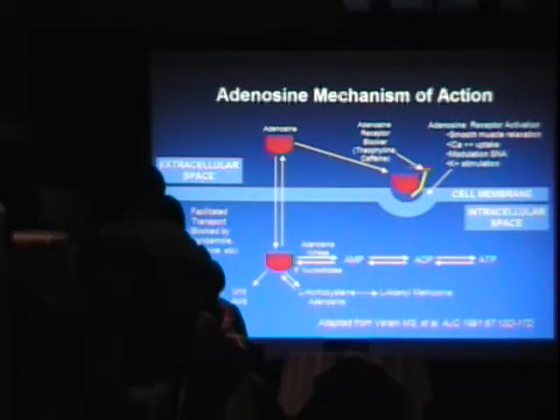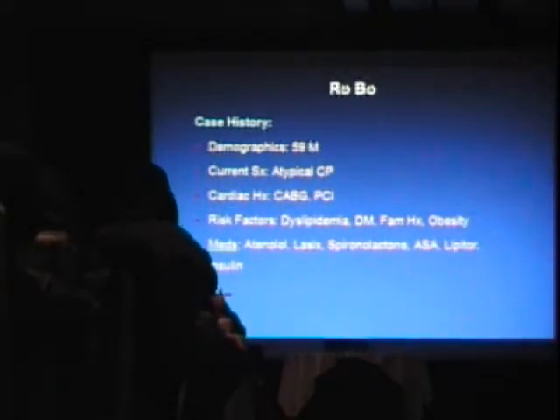Okay, now what happens when you have caffeine that can block adenosine binding? Essentially, you will increase the adenosine concentrations, but the adenosine will not be able to bind to the tissues, and you will be unable to produce vasodilatation. So bottom line is, make sure you screen for potential medications that interfere with adenosine action, and for beverages or food that contain caffeine. And this is the most important quality control step that needs to be done before the test is actually performed.